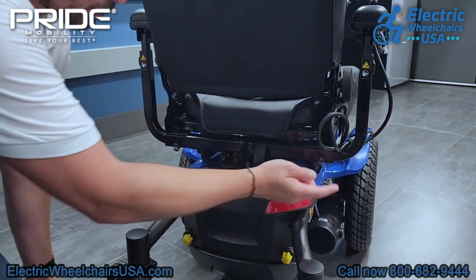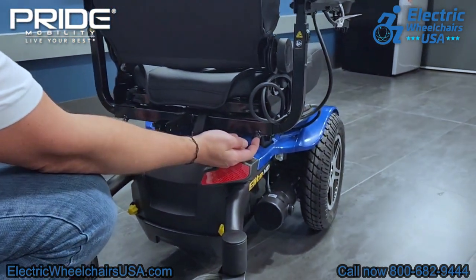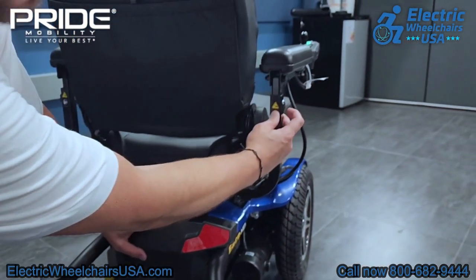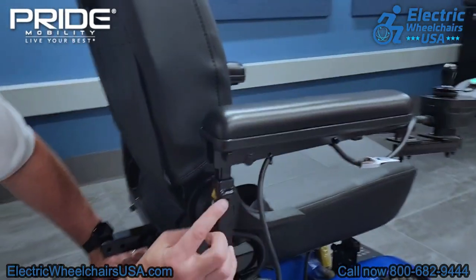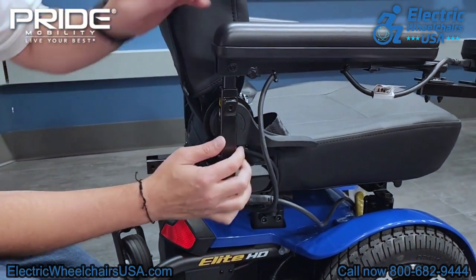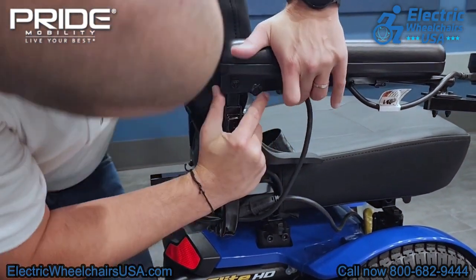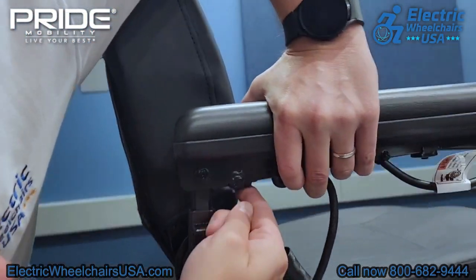The armrests are width adjustable. There is a tool that comes with the chair, so you have to put it in these two little holes in order to adjust the armrests outward. You would also use that same tool to adjust the height of the armrests, and the armrests are also angle adjustable.